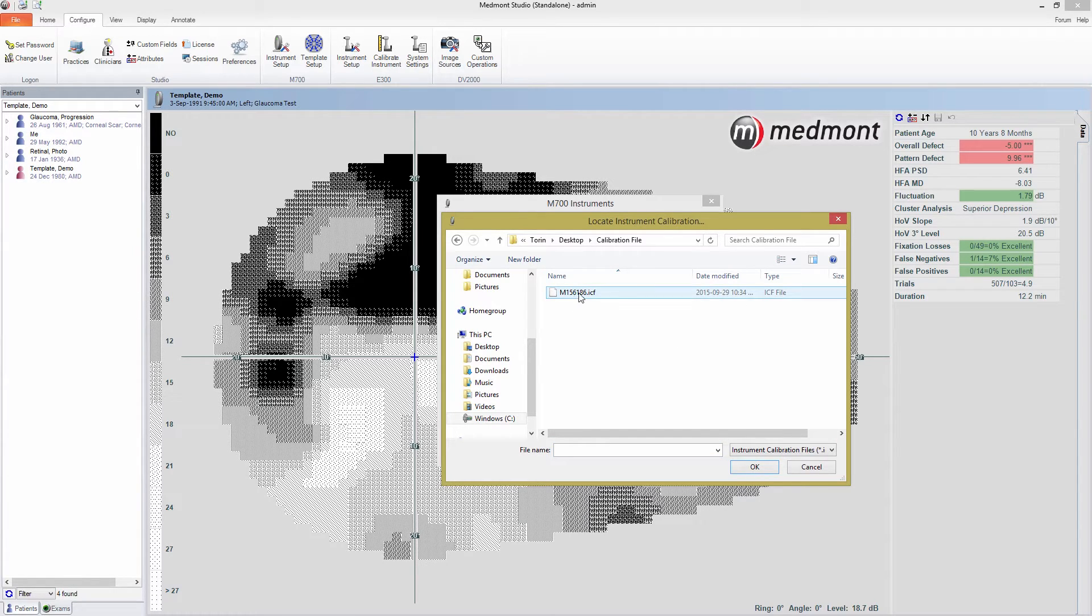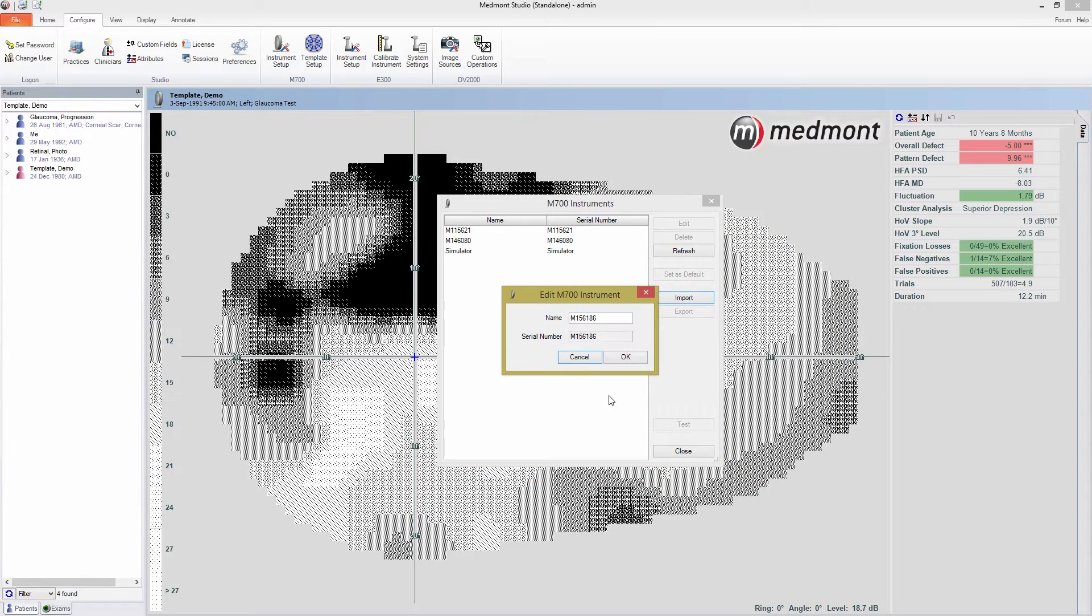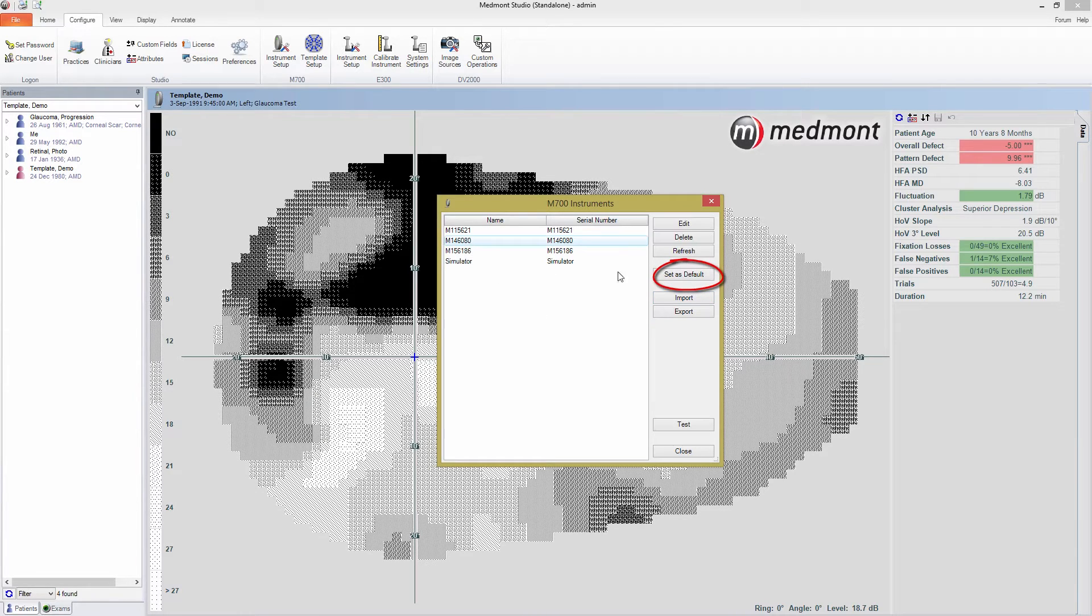From this window, you have a variety of options. If you have more than one perimeter installed, you can select one and set it as your default perimeter. With the default instrument selected, when you start an exam, the test window will open with the selected instrument.